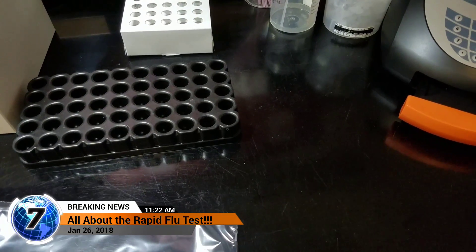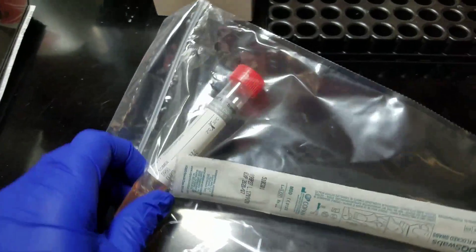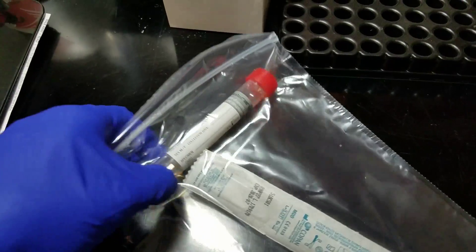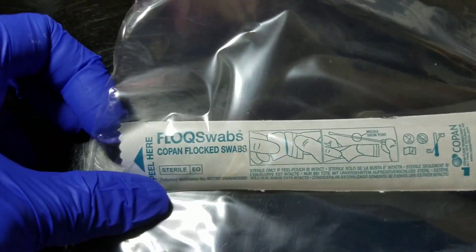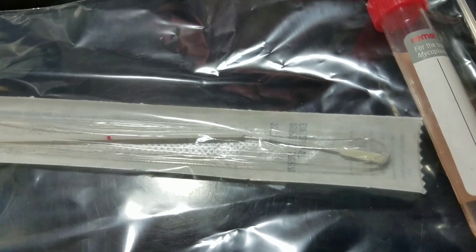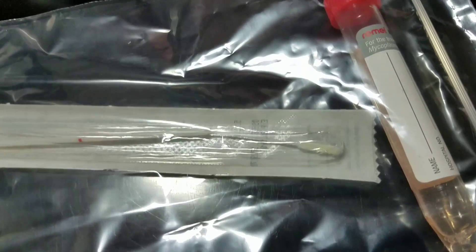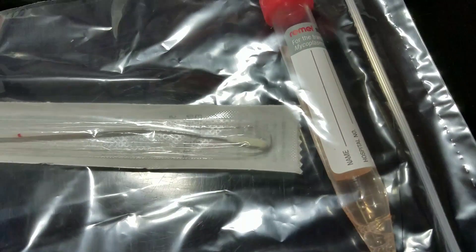Here is our little flu station. This is what a flu swab will actually look like for the most part. This is for any type of virus — it's a viral swab. This is what's called a flock swab. It's like a spiky little q-tip basically, and that goes up your nose and back to the back of your throat. The better the nurse or whoever is collecting it jams it up there, the more likely they are to detect the virus if the flu virus is there.